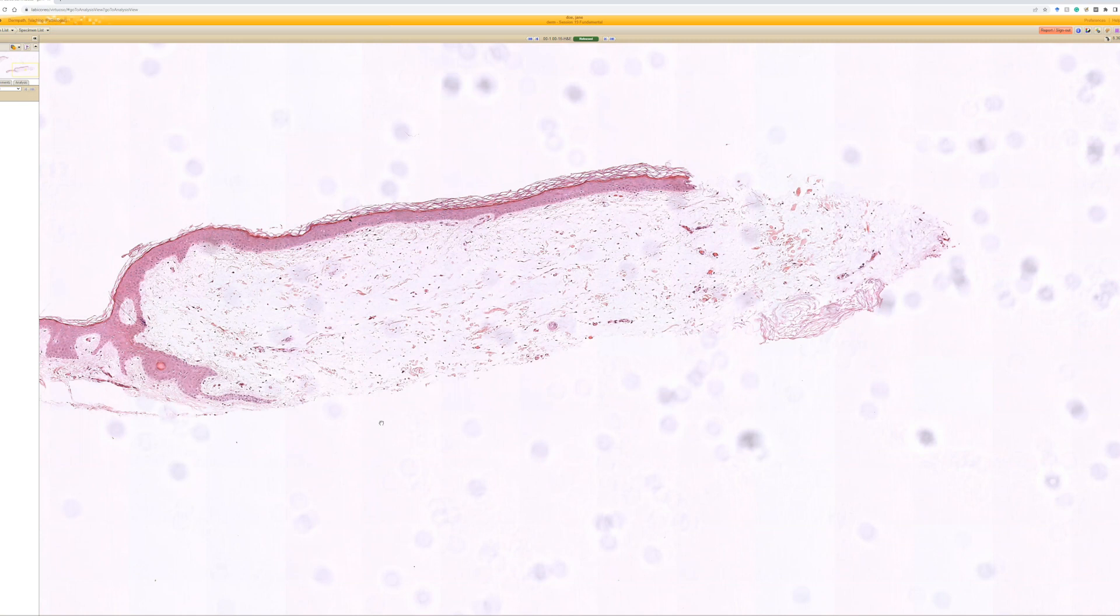a little papule or a little microscopic collection of mucin that is localized and is not associated with any other disease, to my knowledge.